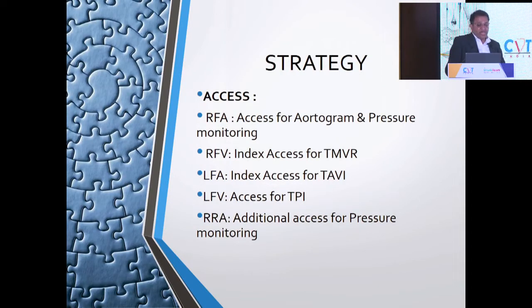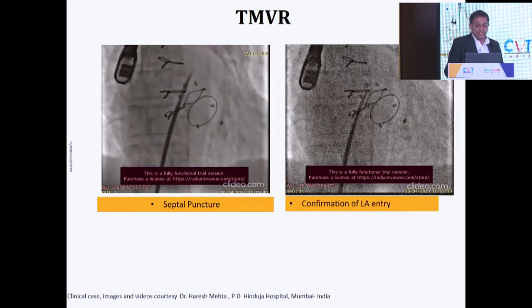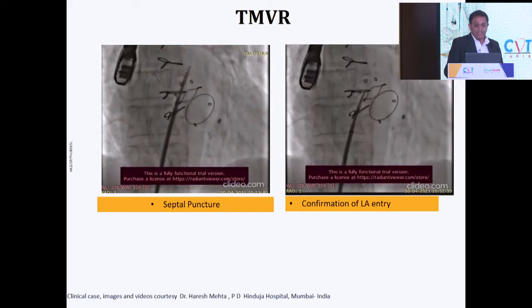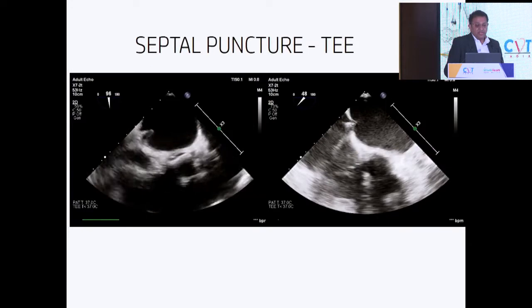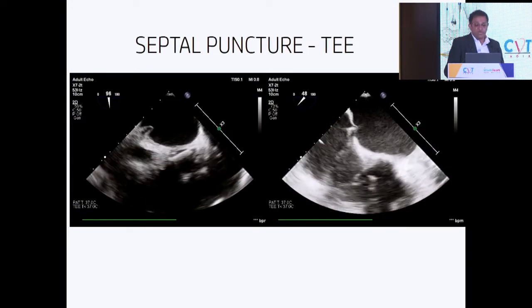So right femoral artery access was for the aortogram and pressures, right femoral vein was for the TMVR, left femoral artery was the index access for TAVI, and left femoral vein was for the TPI. In our initial days, we used to take additional access for pressure monitoring. So this is how we started. We first did the septal puncture, TE guided. We wanted to be sure that we are inferoposterior.